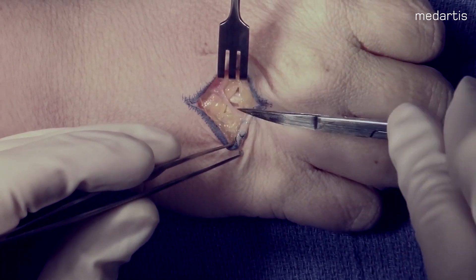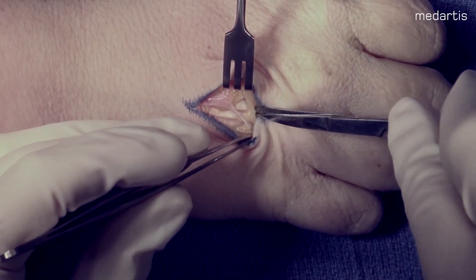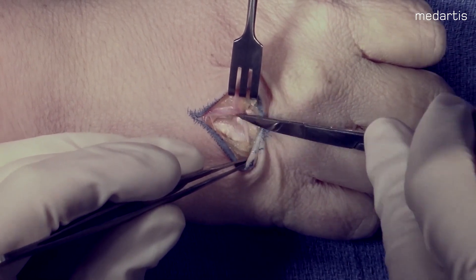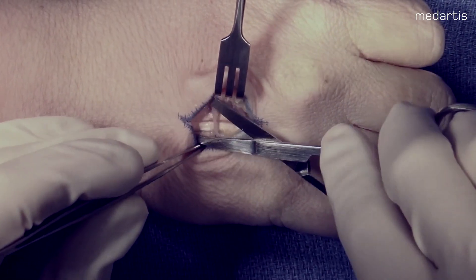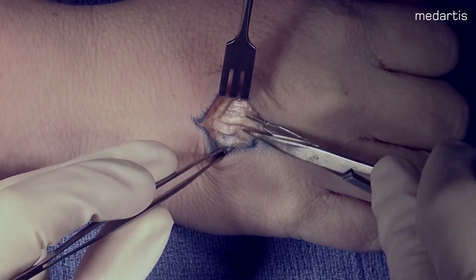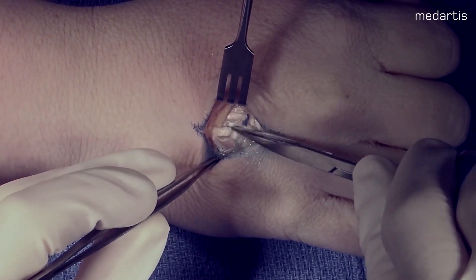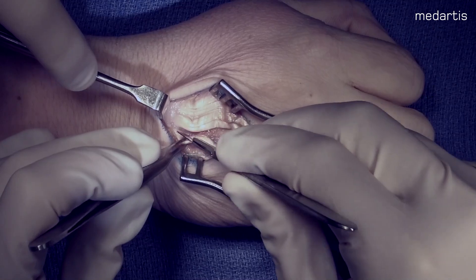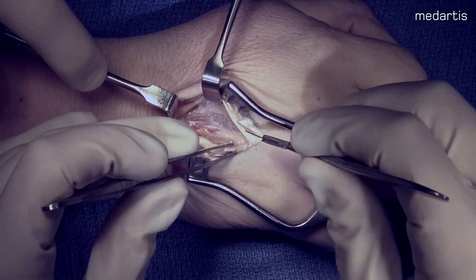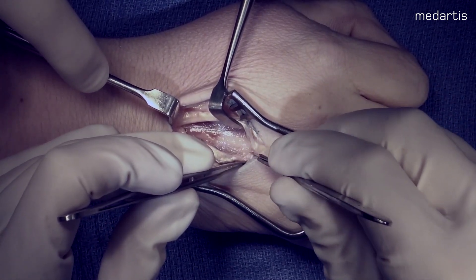you will see multiple veins and nerves. The goal is to protect those superficial cutaneous nerves while coagulating the veins as needed. On the specimen, you can see multiple slips of the EDC to the ring finger. We will approach this by splitting between those multiple slips. Here you can see we're coming down on the fourth metacarpal. We do not want to go distal to the metacarpal head or disrupt the sagittal band.